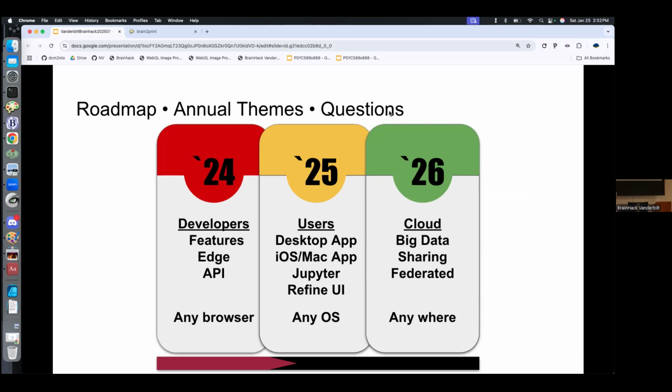One of the things that's interesting about this is, I historically come from writing desktop applications, and then you have this challenge. Windows uses DirectX, Linux uses Vulkan, Mac uses Metal, but it's interesting that the language we use is the intersection of those three tools. They're saying these are things that will run very high performance. As long as you stay within these things, they won't use a lot of batteries. And so through what Google calls Angle, the almost native graphics layer, we use whatever happens to be the best driver for each device.